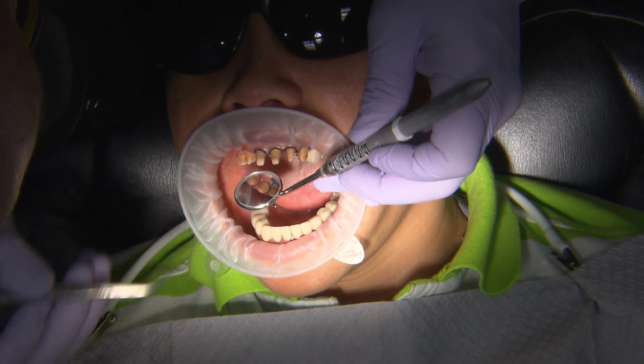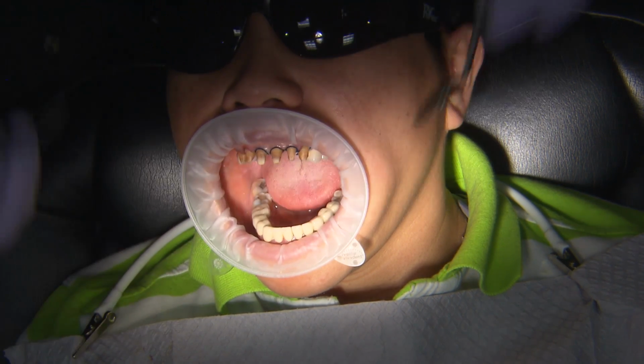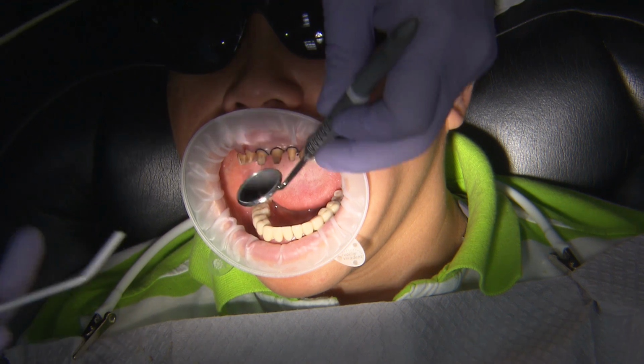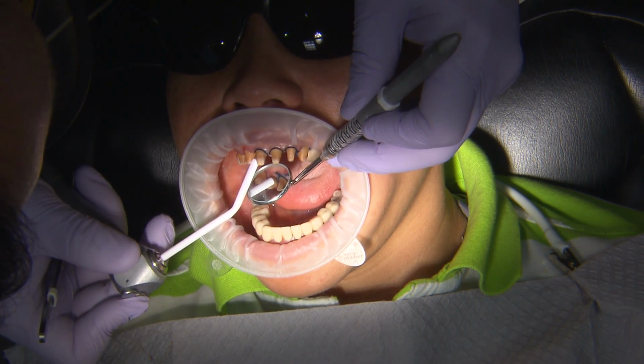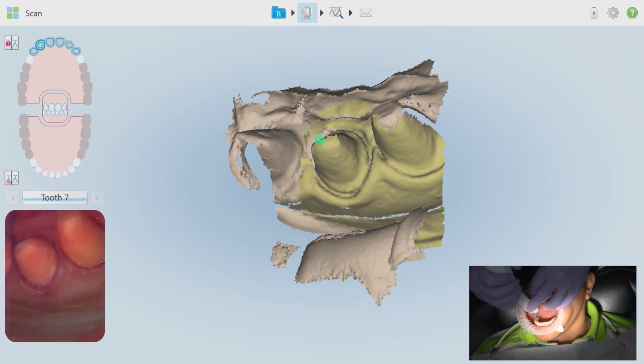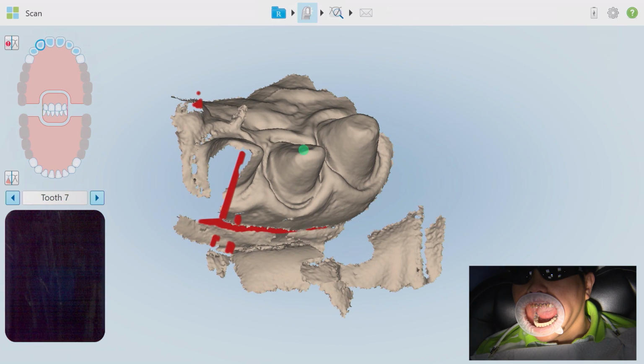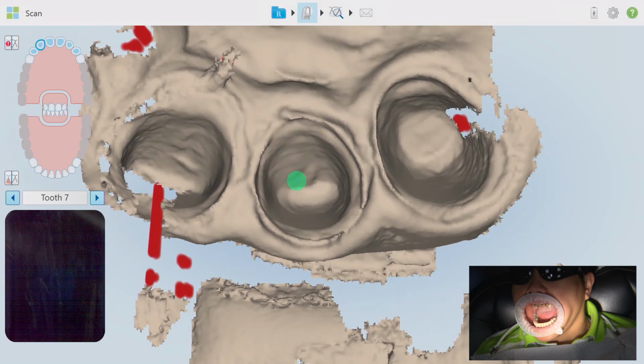I'll once again remove the top cord only. Give a second look to make sure the removal of the cord does not dislodge the remaining cord or even one in an adjacent sulcus. Once you're ready to scan, dry the area and once again perform a 5-second scan of this preparation's details only. Review it once completed and move the incisal locator dot as a final step.